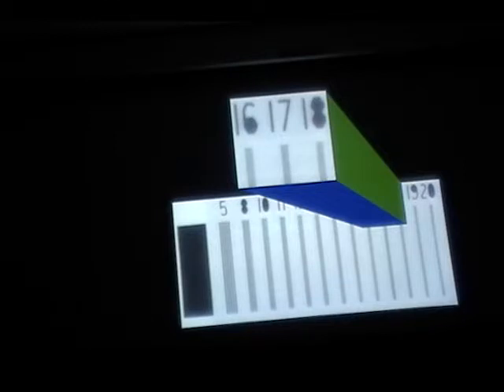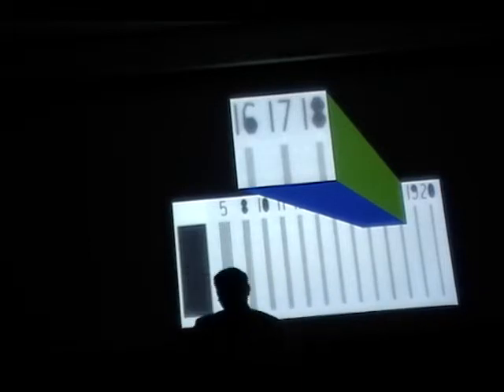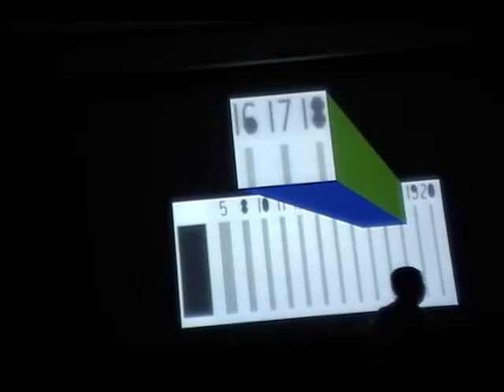And if you are in the state of Ohio, every 3 years the state will come and do the inspection. And what they do is they check the lines per millimeter. So how many lines we are able to see. And this is the guideline that we use to check the sensors, whether they are working properly or you have to discard them. Okay? Remember I told you earlier, in Ohio there are only 3 radiologists. I can't come to each and every office to look. You have to be on your own.